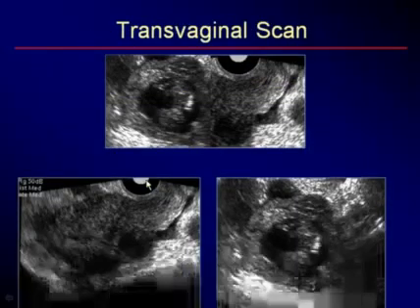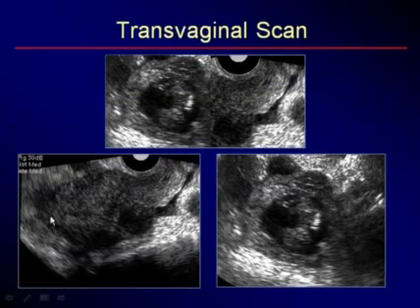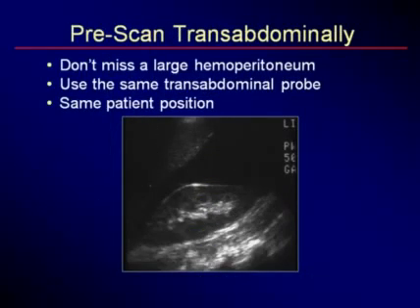And what had happened here was the uterus was pushed way to the side, and the ectopic pregnancy was actually sitting in the middle of the pelvis, so that it almost looked like an intrauterine pregnancy. But because we knew that something was not right, we were able to find the uterus and make that call.